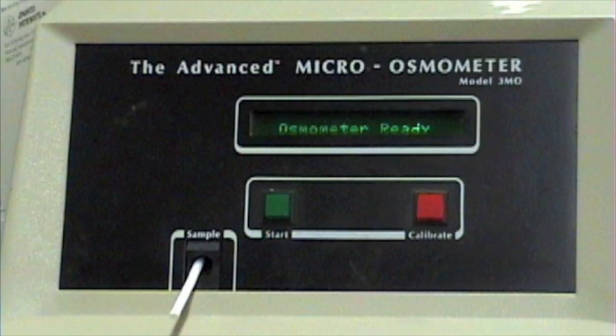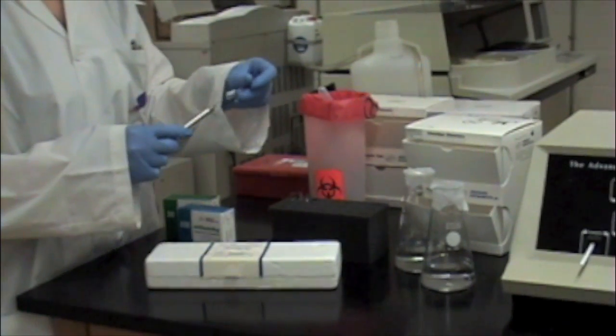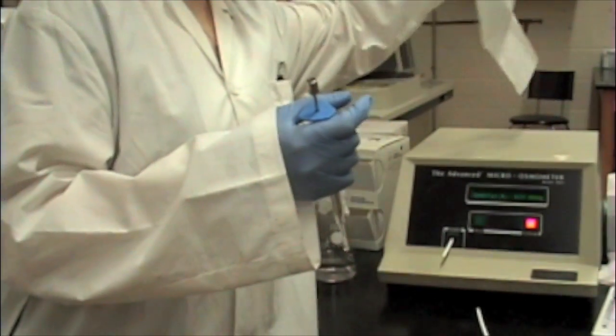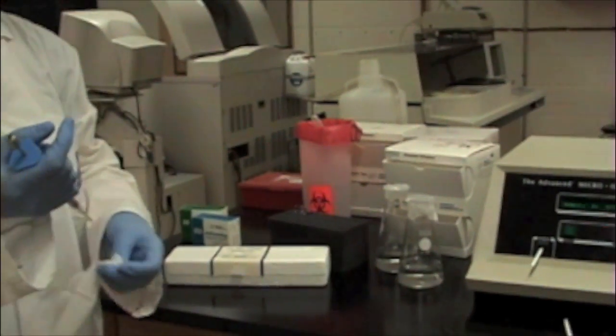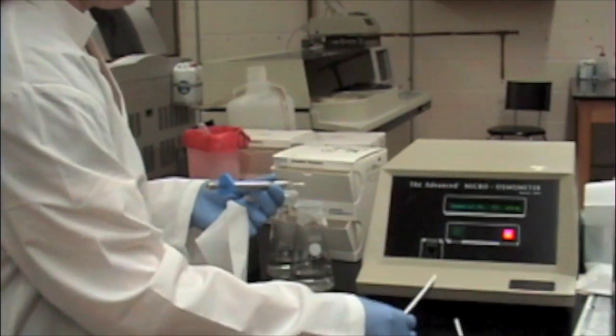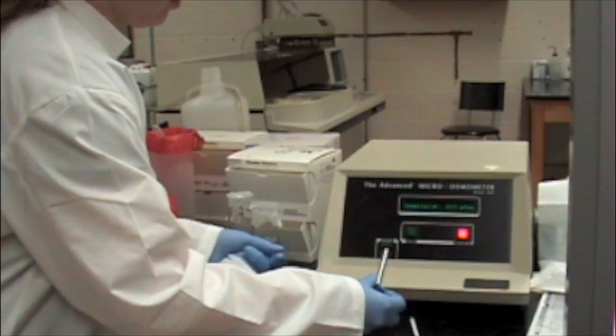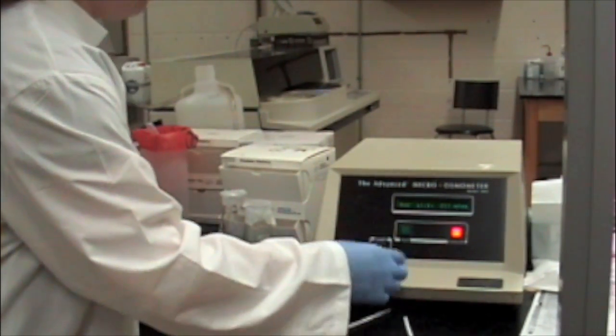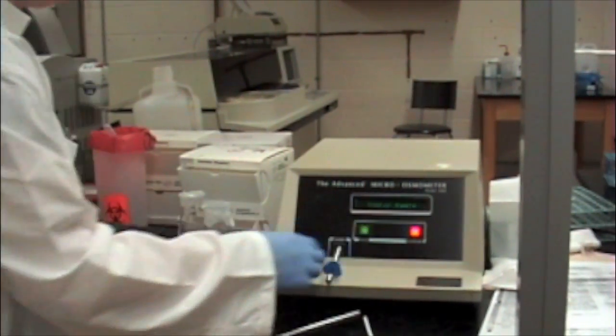After calibration is complete, evaluation of the osmolality of whole blood, serum or urine may take place. Follow the same technique outlined for the calibration. Attach a sample tip and draw up a sample. Wipe off the extra sample from the tip, remove the chamber cleaner, and insert the sampler. Press the start button to begin testing.